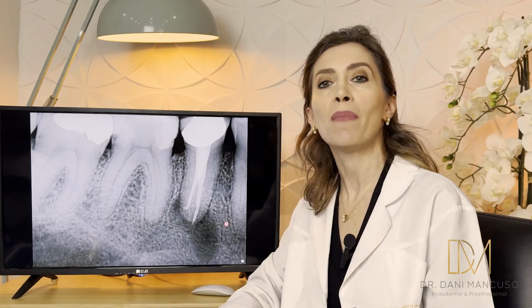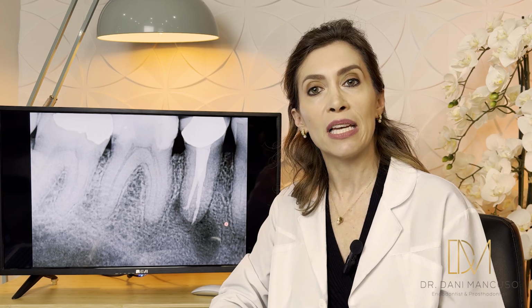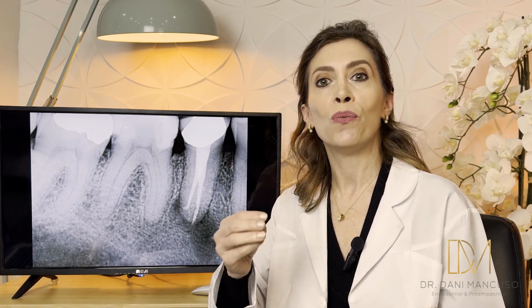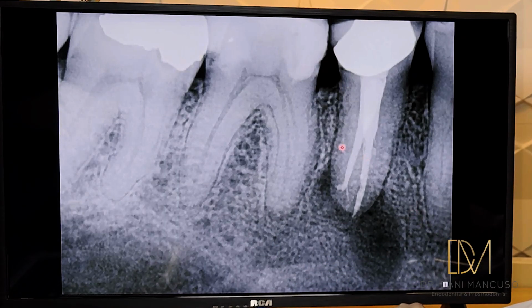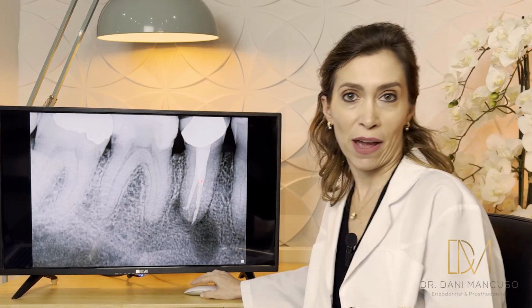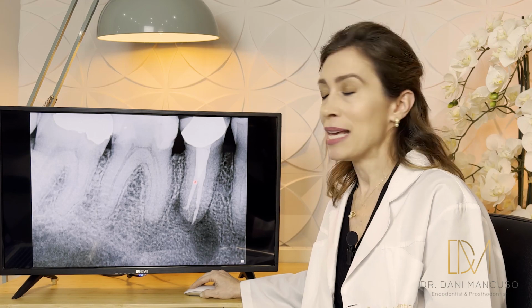If you use magnification, that is much better because then you can see. But if you can't see, my advice to you would be go to the untreated canal first, because once you are there, as you can see here, they join halfway on the canal, so it is mid-root.